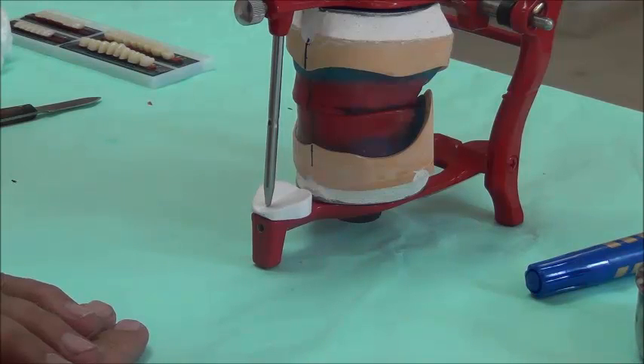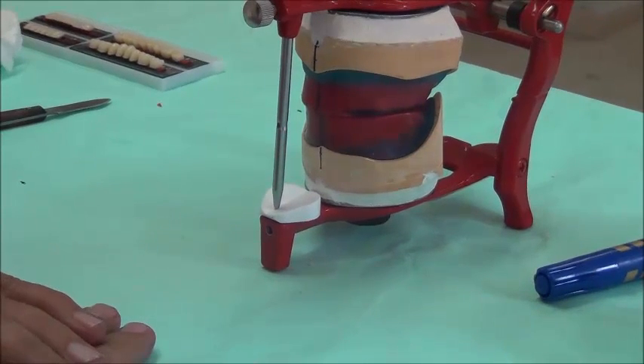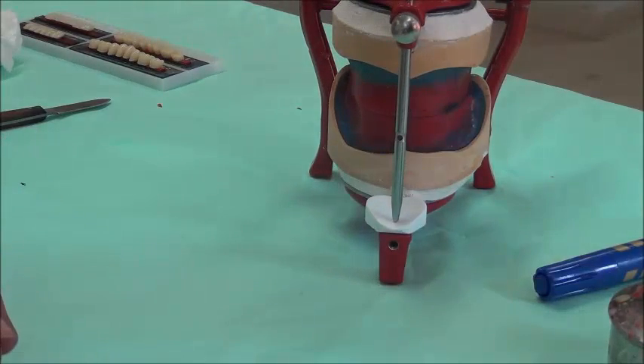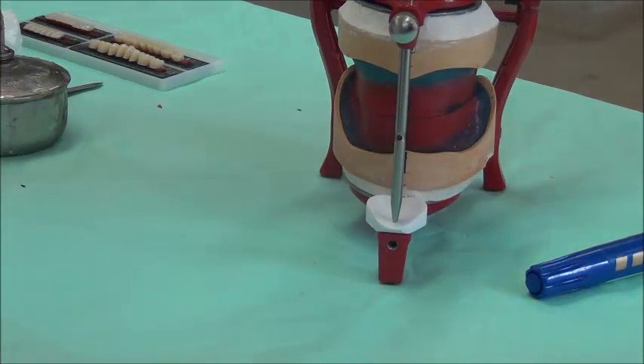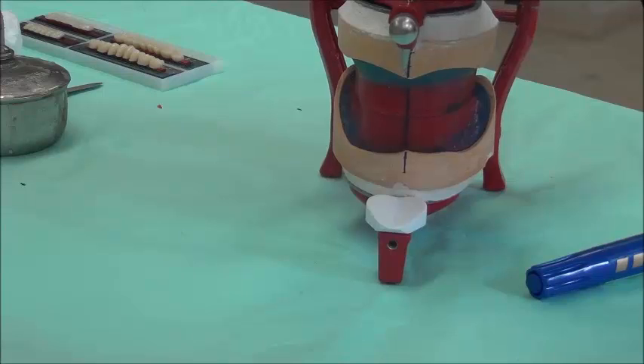You have finished the step where you have mounted upper and lower casts. While mounting, we made sure that the midlines are all in line. We check that by looking at the articulator with the pin and comparing the midlines with the pin so we can confirm they are aligned. Once the midlines are aligned and the casts are aligned in the mounting, we are ready to do the setting.